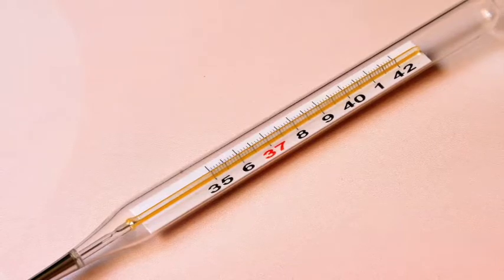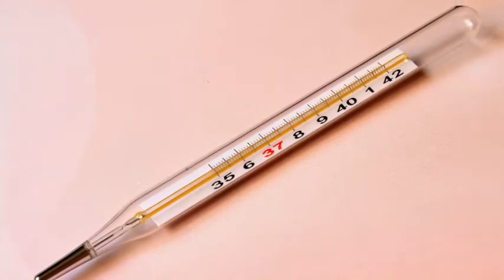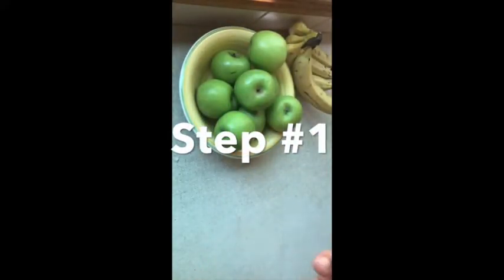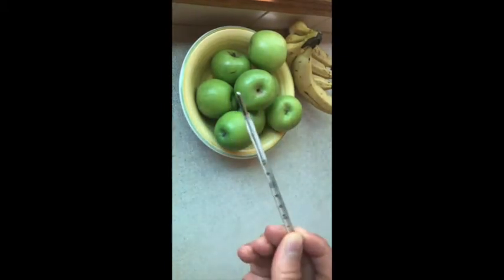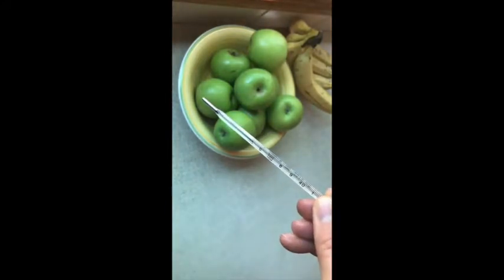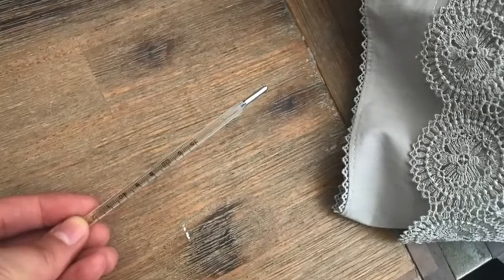Now let's go over the steps on how to use your basal body thermometer to get the most accurate readings so you can track your health and get the results you want. Step one: make sure to shake down the thermometer until the mercury falls between 35 degrees Celsius or 95 degrees Fahrenheit, and place it by your bed at night when you go to sleep.